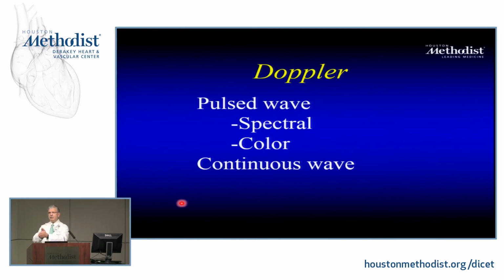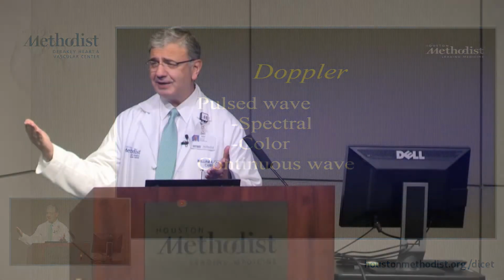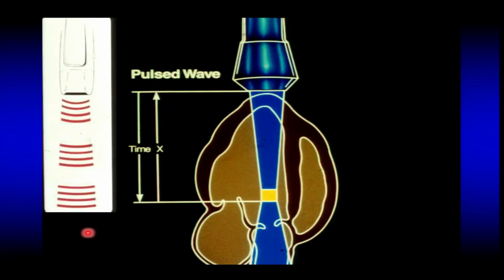So I'm asking a different question now. Send the ultrasound. When I hear back, I'm listening to say, hey, how much frequency shift occurred? Right? If it is high, the velocity is higher since it's directly proportional. If it is low, provided that I'm not at a significant angulation. Okay? So let's take it to the real world. Pulse Doppler. What does pulse Doppler mean? Meaning I have a region of interest right here. This is the region of interest where I'm interested in what's happening to this velocity.